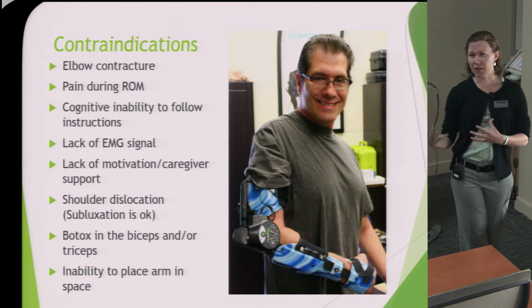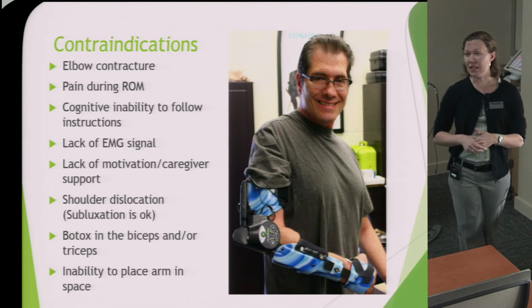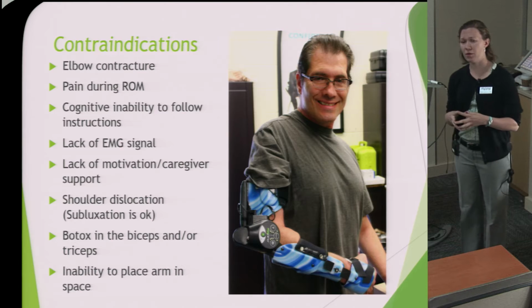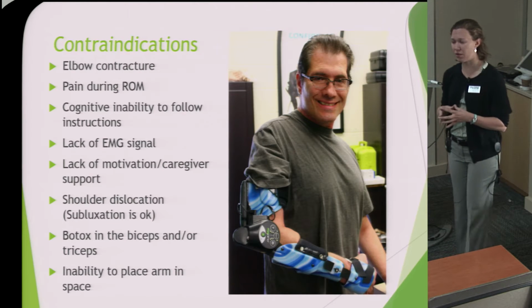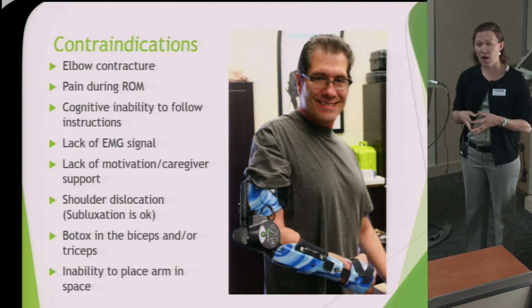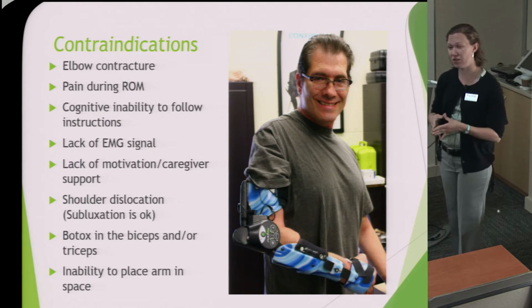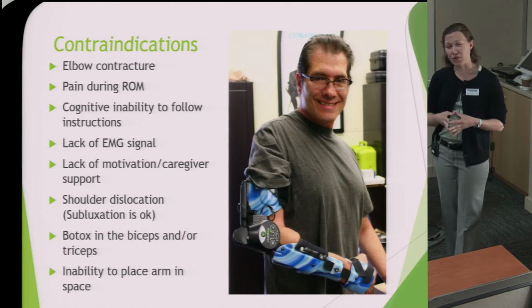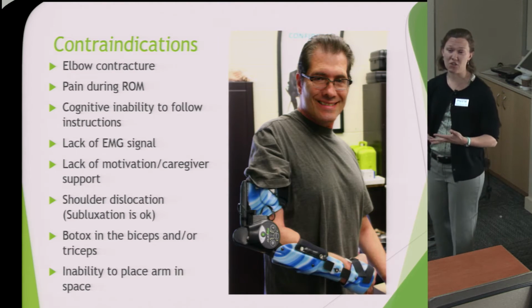We discussed the inability to place their arm in space. The other one that's listed on here that's a little bit unique is Botox. If you do have a patient who you are giving Botox to, they should discontinue receiving Botox in their biceps and their triceps if they're using a MyoPro. Botox is an EMG inhibitor, so it's going to cause that EMG signal to fall or to become very, very erratic. It's very frustrating for the patient, very frustrating for the caregiver, and for the care team in general.